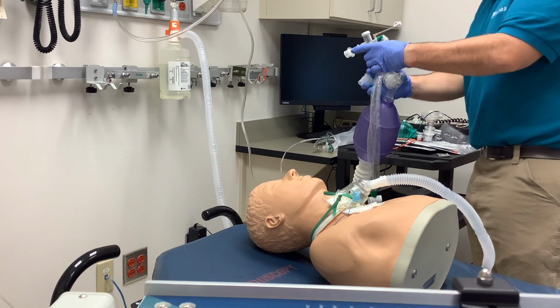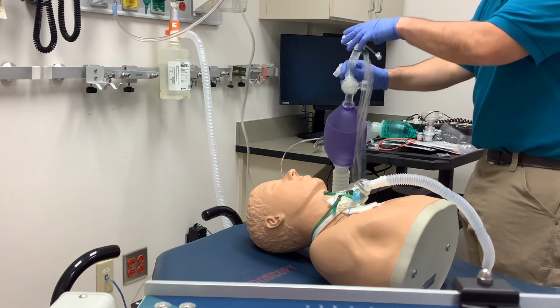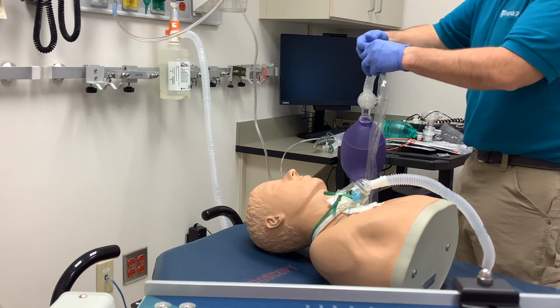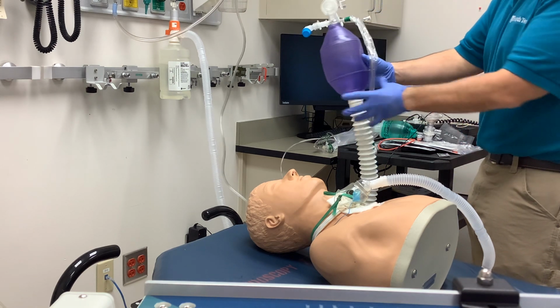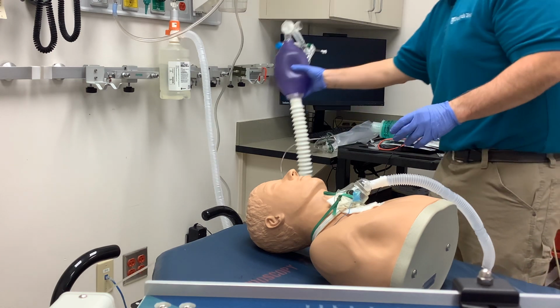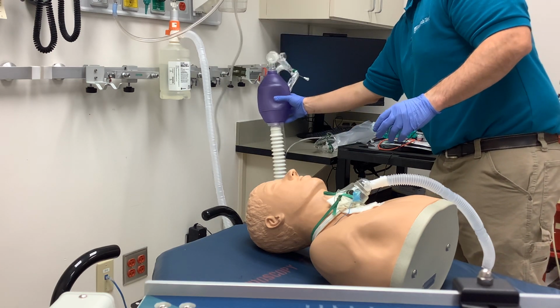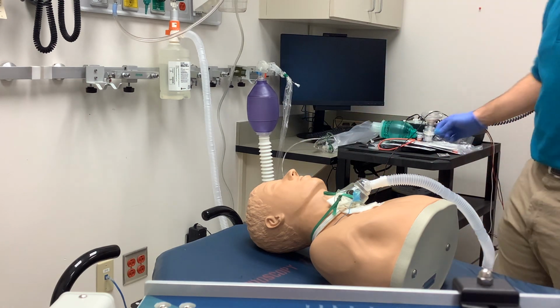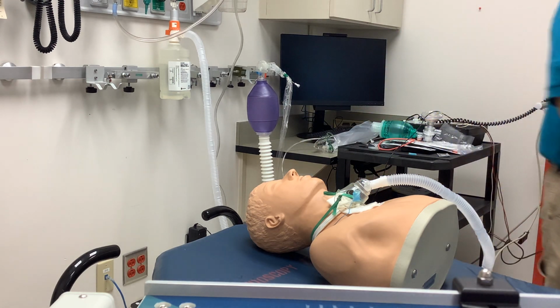And then this stays clean and sterile to this patient as long as you keep this covered or capped. So you can take a cap and put it in the end of it, and if you've got to ever suction your patient again, you've got a sleeve catheter that can be used for that patient again when we're ready to do that. So that's all I've got for open technique suction of your patient. Go ahead and turn this off.